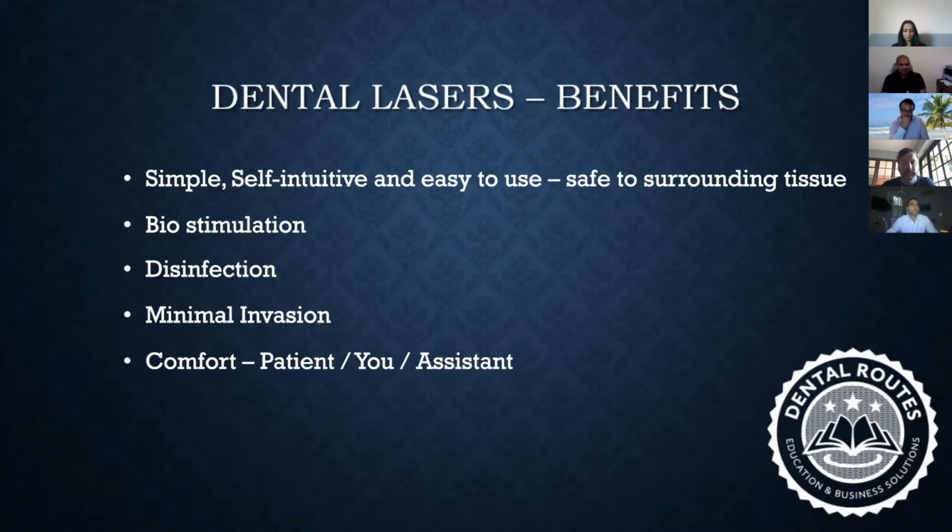Biostimulation. This is something, again, which is a bit new in the dental field. It's nothing but increased healing. Every time you use laser, it's as if you're putting additional batteries into the cells. Cell repair is increased multiple folds. This is something that can be gone into in depth, and we can speak about it for hours. That is why I think we are going to have a few more meetings as we go forward to ponder each subject, but I'm just touching upon this. So whenever we use laser, there's a high amount of healing that happens within the tissue.